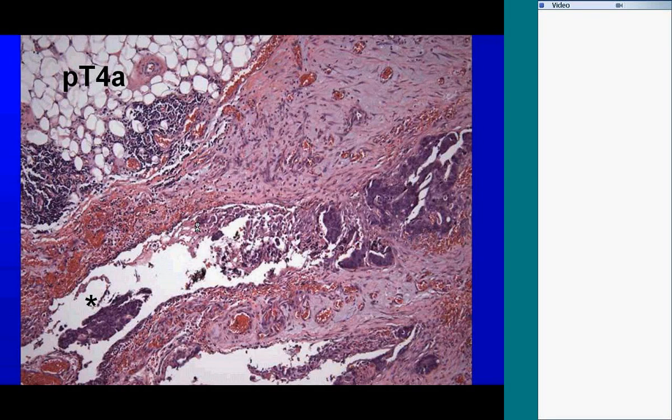This can be a little bit difficult to assess, and I think that we are underreporting this serosal surface or local peritoneal involvement. When you're grossing in a specimen, look at the clefts on the serosal surface near the tumor. The tumor is often invading in one of these little clefts or between fibrous adhesions in the specimen. You can see here microscopically the tumor has eroded through the peritoneal lining, and there's actually tumor floating free in this cleft-like space. Same thing going on here.